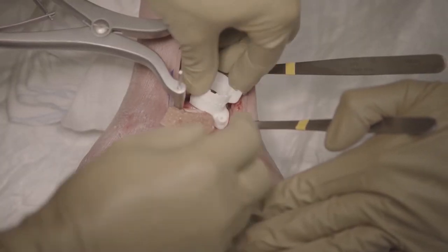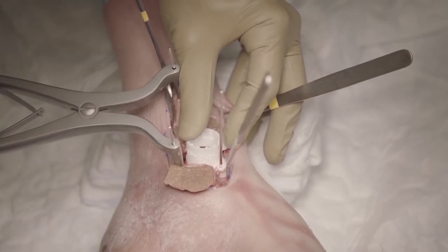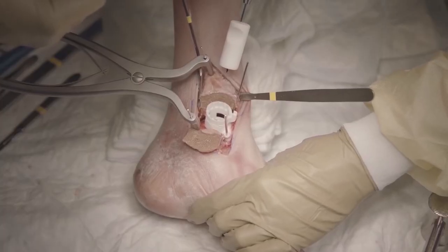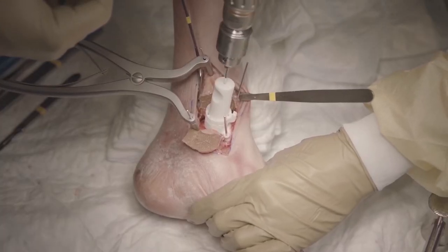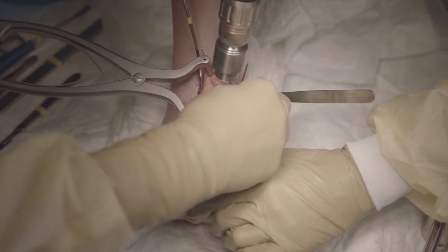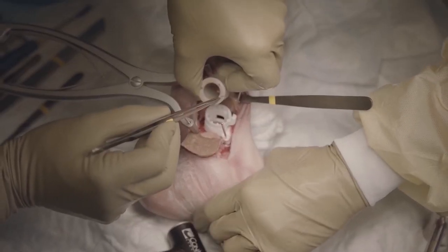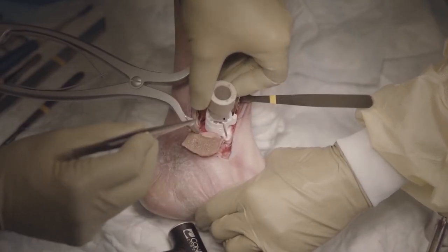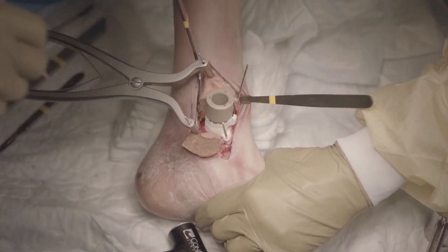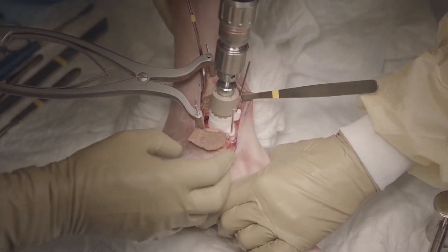Then we will place the AP guide. There is only one position in which we can place the AP guide. Make sure the AP guide is flush with the cartilage surface and then we secure it with 2 K-wires. The pin socket with a 2 mm K-wire is used to drill a central hole, which will accommodate the drill introduced through this drilling socket. Check that the socket has bottomed onto the AP guide and then we will drill it.